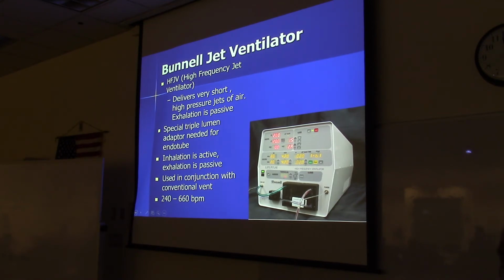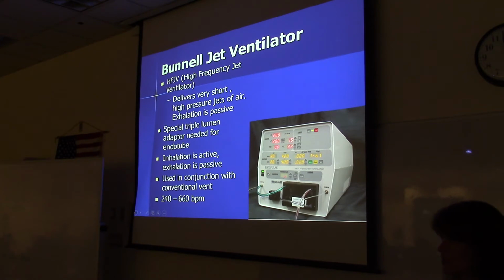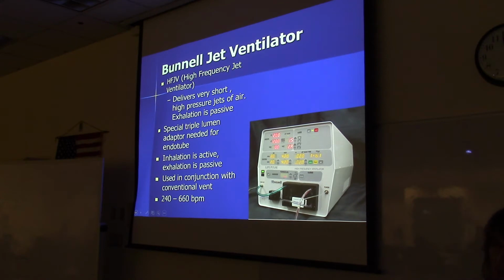The jet ventilator delivers very short, high-pressure jets of air, and the exhalation is passive. With the oscillator, it was an active exhalation where the piston pulled the air back out of the circuit. With the jet ventilator, that doesn't happen. It only interjects air in and then allows exhalation to be passive.